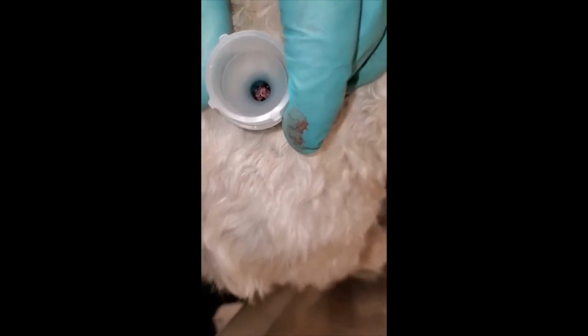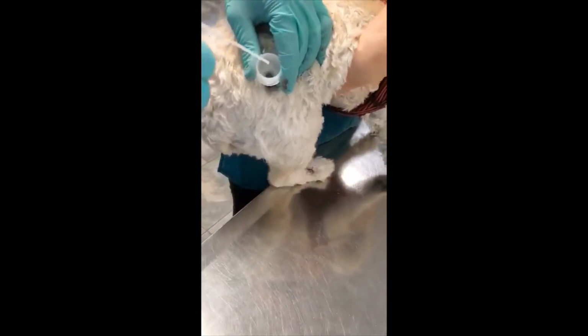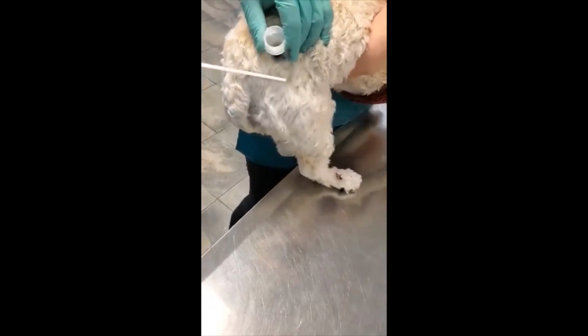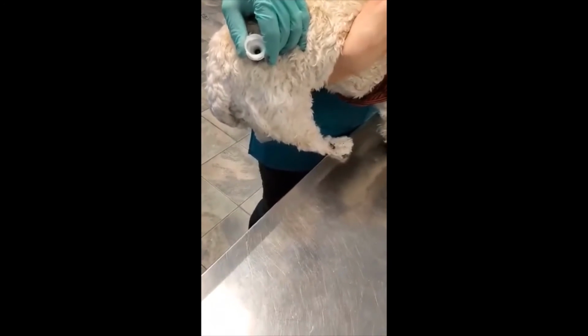In contrast, we're going to utilize a, let's call it, a less exacting procedure, which is to utilize the cone to isolate the lesion and then apply cryo to it. This is a much less exacting procedure. I don't know if you noticed, but it is splashing out of the cone, and I just got hit in the eye with a little bit of the cryo solution.